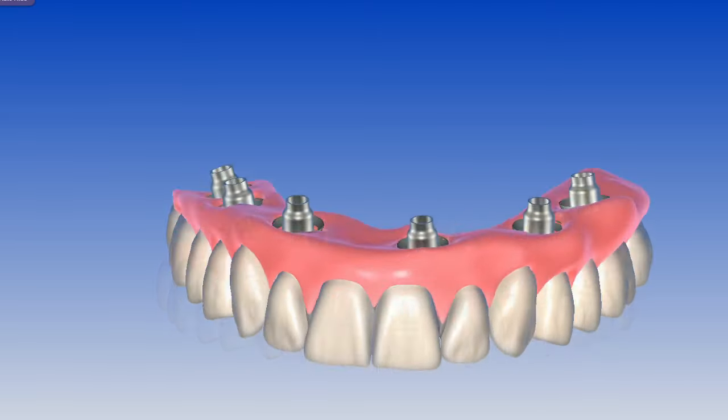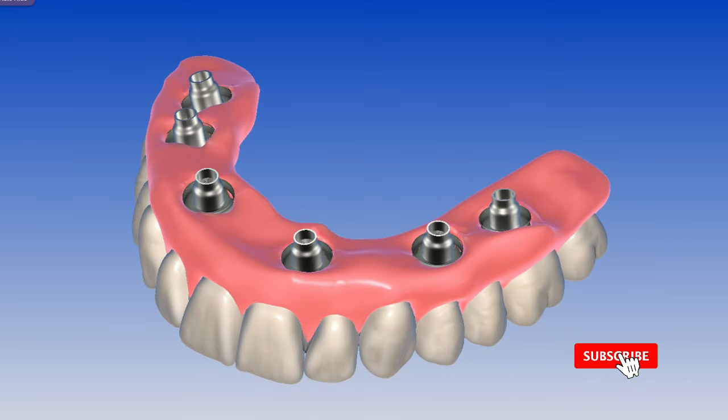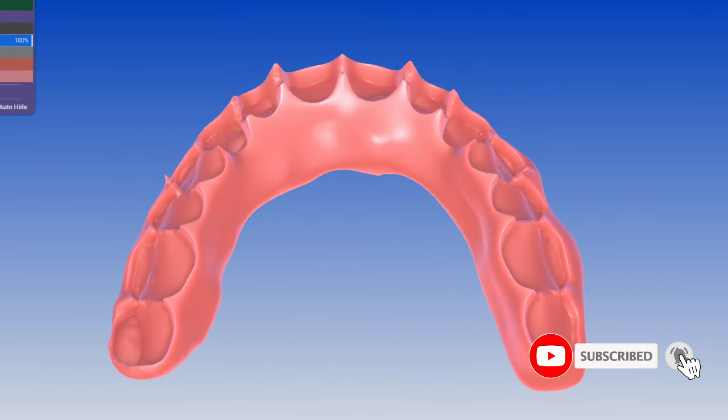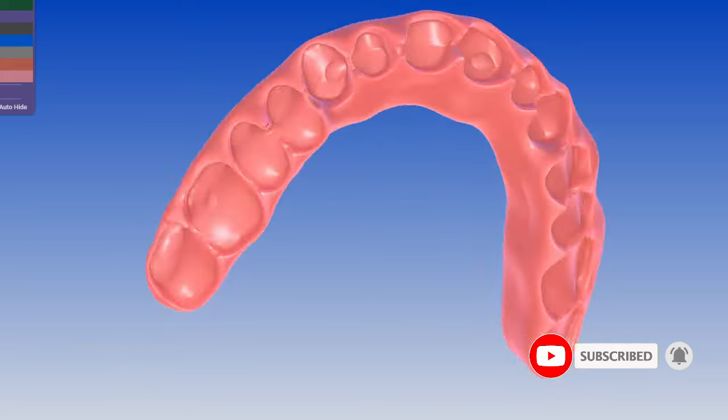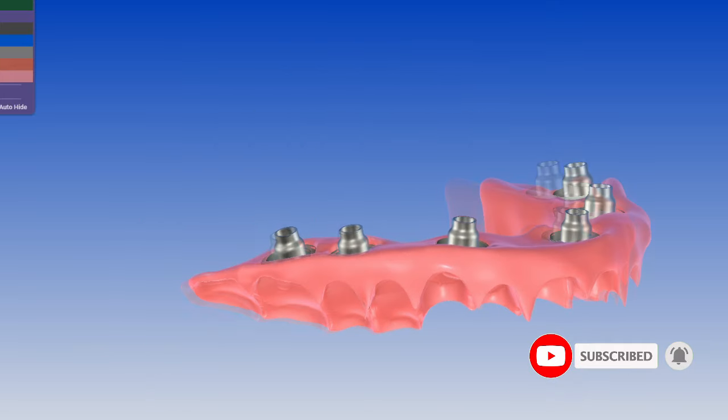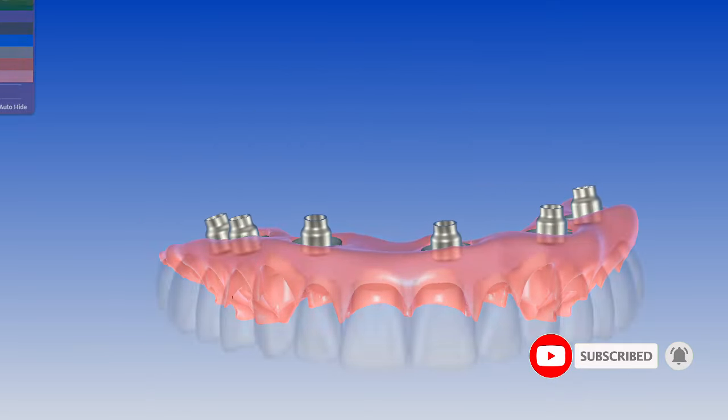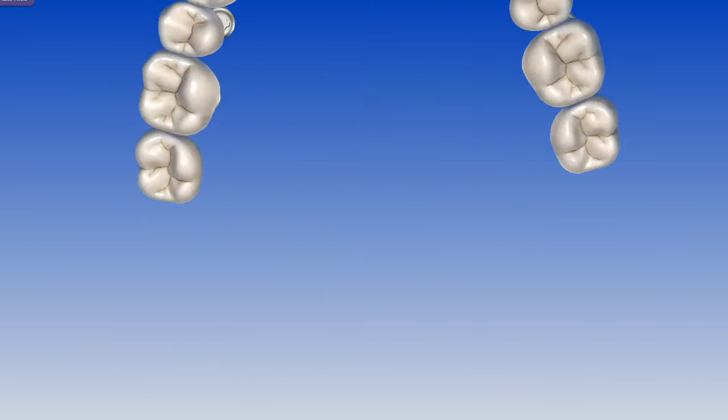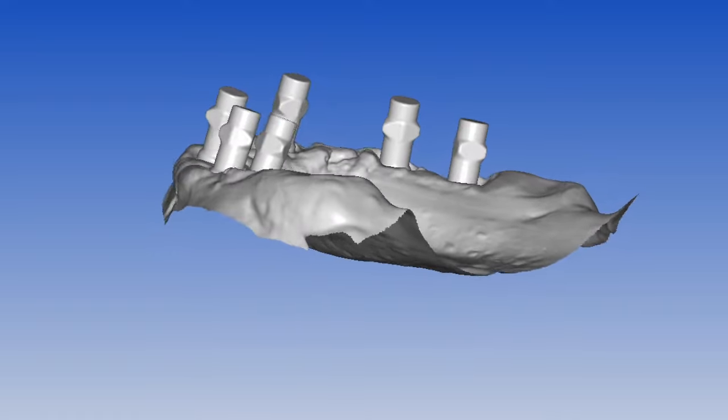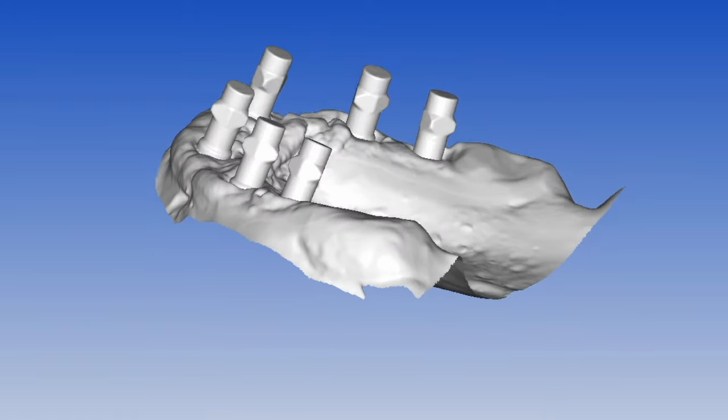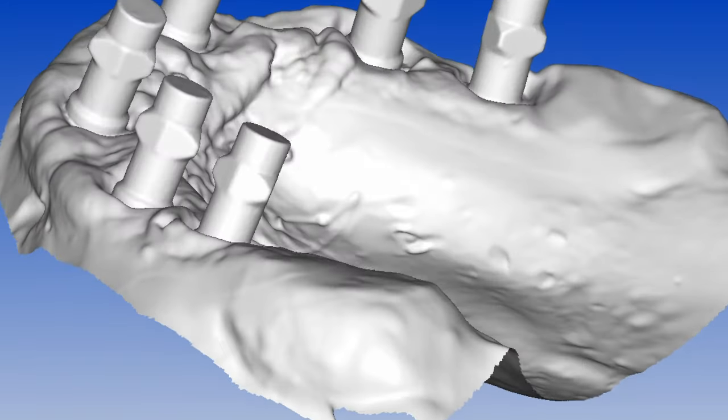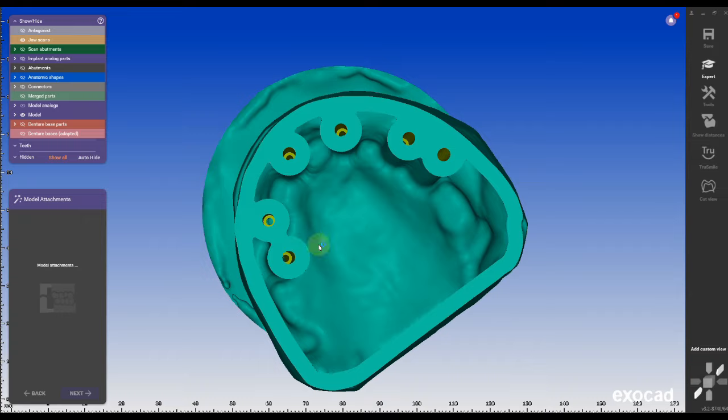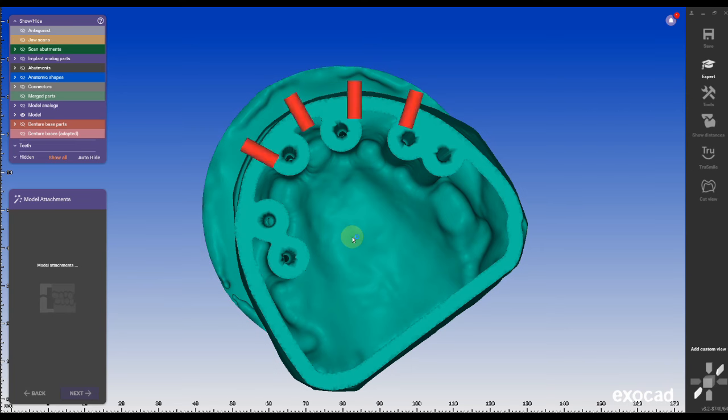This is a fully digital workflow for zest locators where you can select locator height, design a locator fixed restoration or locator overdenture in one seamless workflow, and even print a model to pick up the housing in the end.